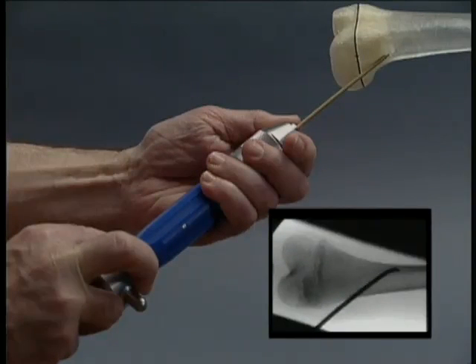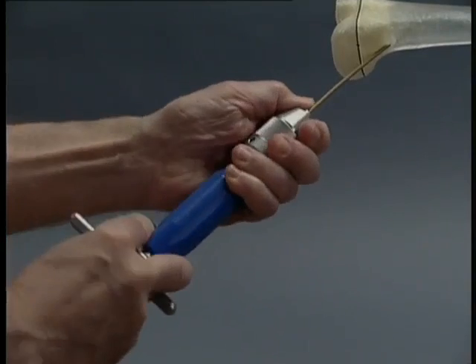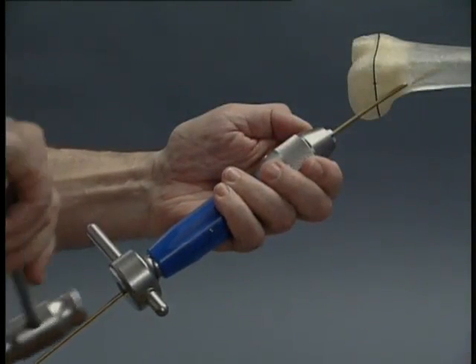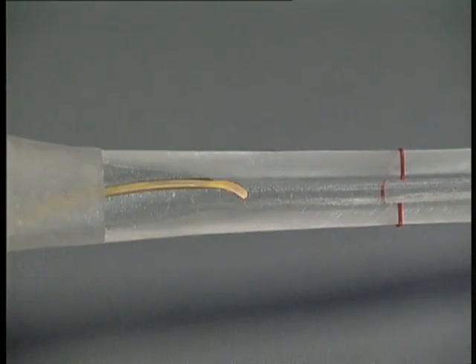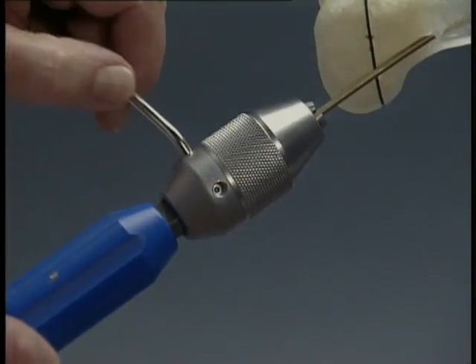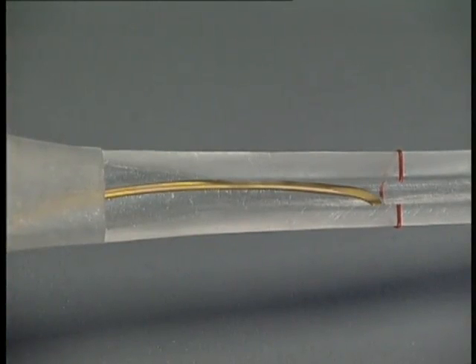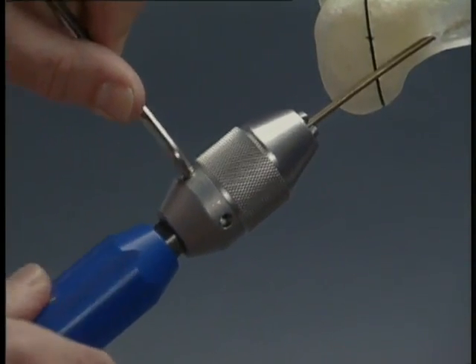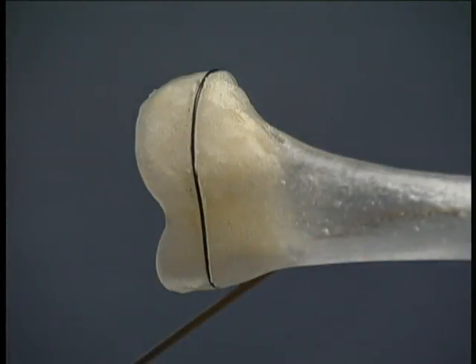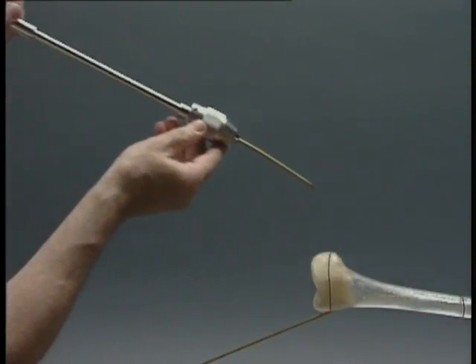If necessary, the position of the tip is checked under the image intensifier. The nail is advanced into the medullary cavity manually, using rotating movements or with gentle taps of the combined hammer against the striking surface of the inserter — the tip piece must not be struck. If necessary, the nail can be further tightened with the pin wrench and advanced to the fracture zone. At the opposing insertion point, the medullary cavity is opened in the same manner, and a nail of identical diameter pre-bent in the same way is inserted into the metaphysis, here shown with the long inserter.